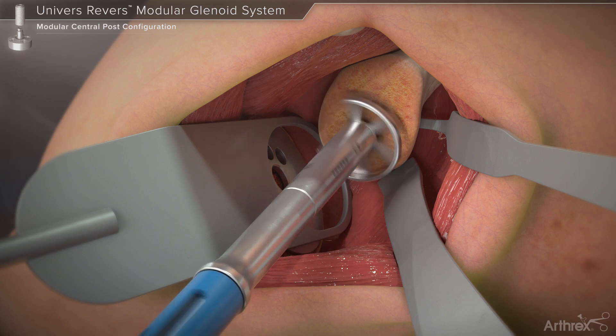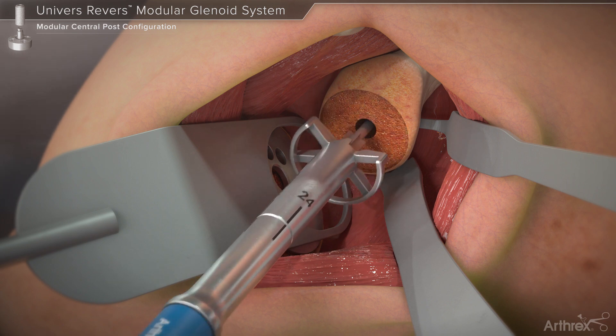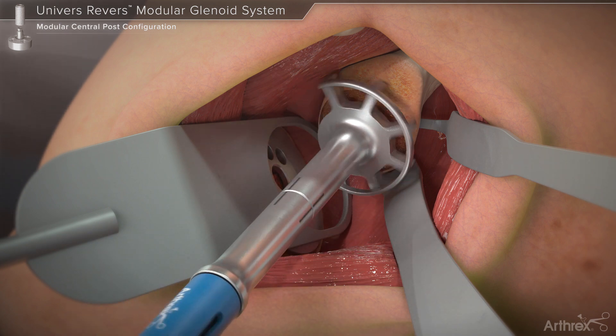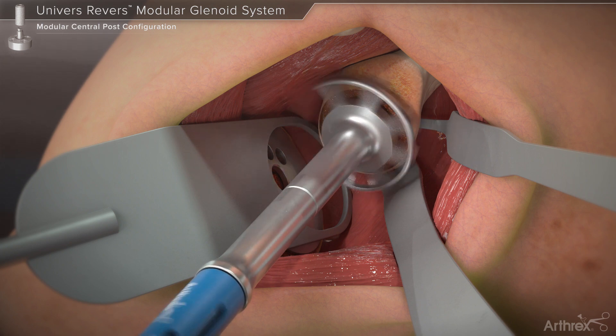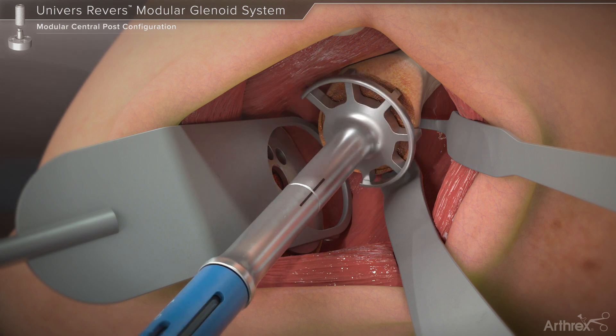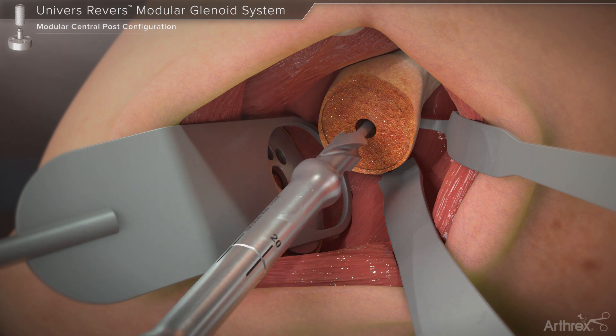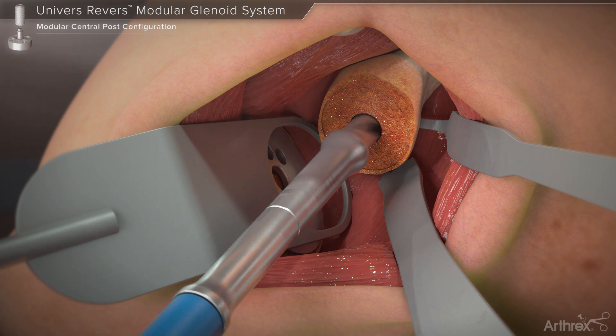Reaming should be continued until conformity between the reamer face and glenoid surface is achieved. Next, the peripheral reamer is used, which corresponds to the size of the desired glenosphere. This reamer has a positive stop and will clear tissue to allow for glenosphere seating. The drill tip is selected and attached to the modular reamer shaft.